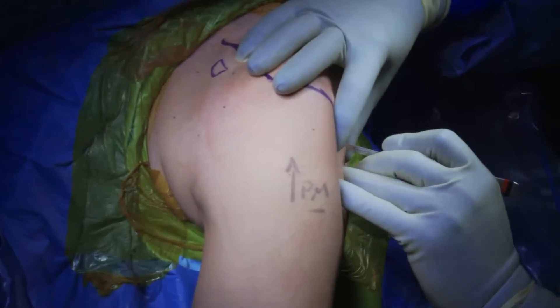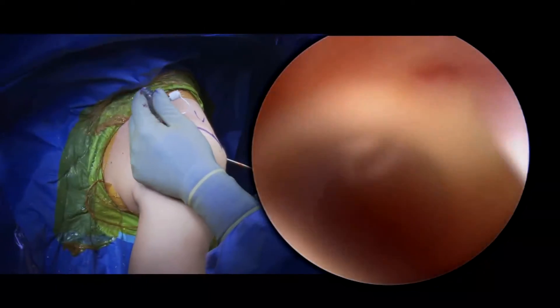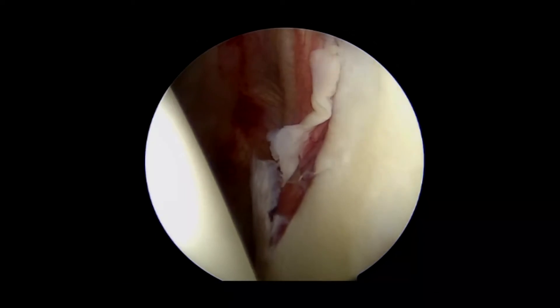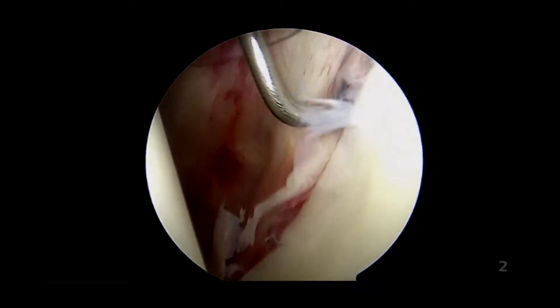We begin by performing a standard posterior portal followed by a high anterior superior portal through the rotator interval. We then perform a standard diagnostic arthroscopy looking for pathology in the anterior inferior labrum.